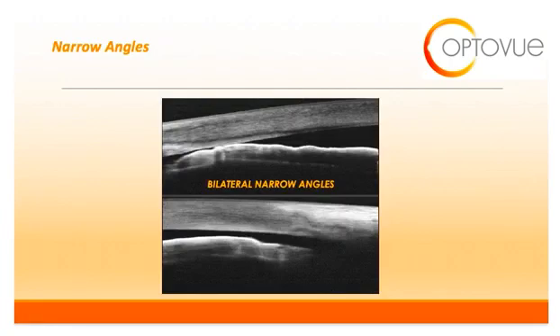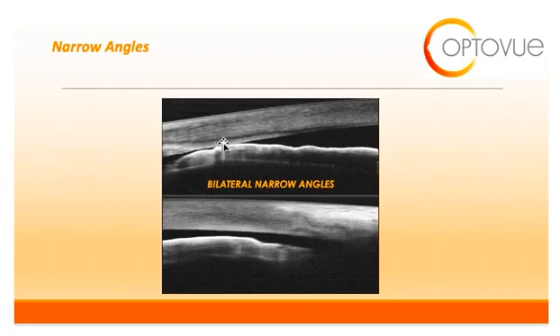On this slide, you can see what a narrow angle looks like on OCT. You can see the anterior placement of the ciliary body in apposition to the cornea. The angle here is completely closed off, as we are not able to put calipers in to measure the distance between these two structures.